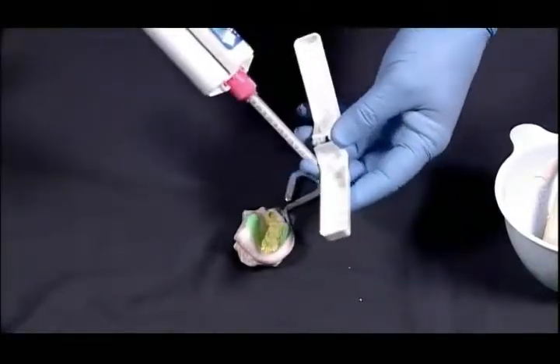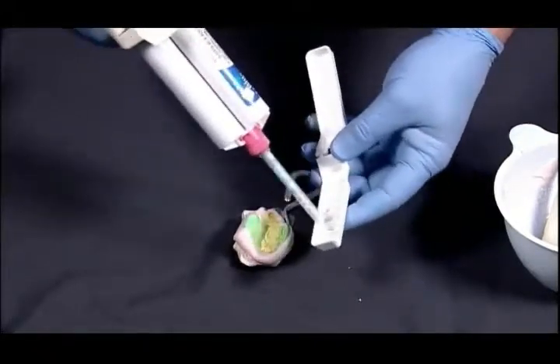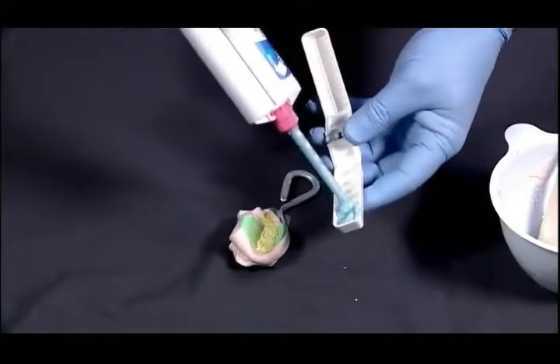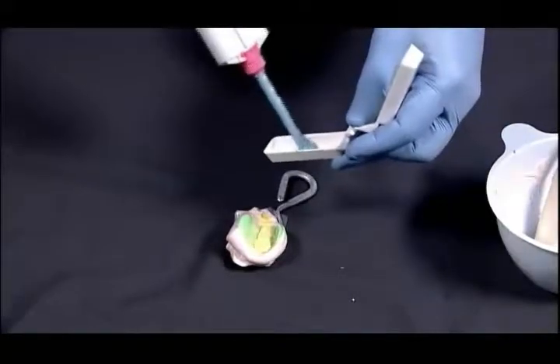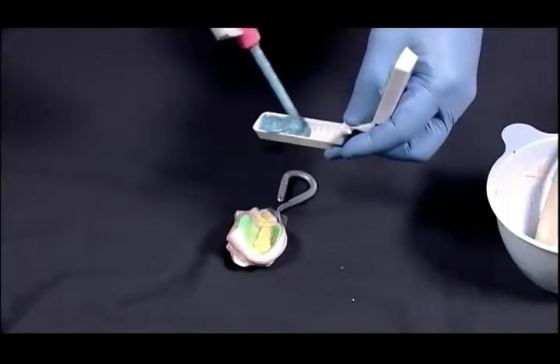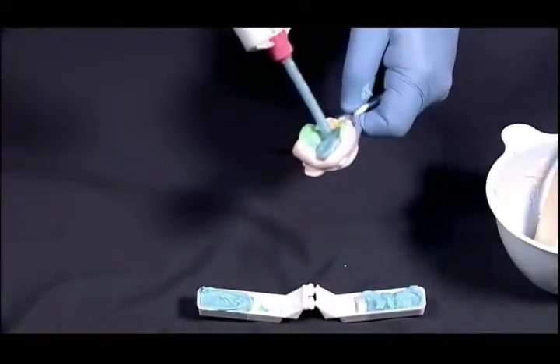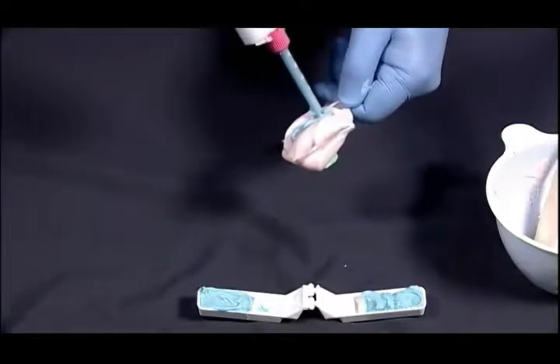This particular case we're using Blue Mousse from Parkell, and I'm going to syringe this as fast as I can into this model because it's going to set up fast under these studio lights. And all we're doing is making sure that we can articulate this whole system back together, so when we're done we have an articulated model to work from. All right, we have that. We're going to start our mounting process. The opposing model I can actually pour utilizing this material. I'm just injecting it down inside of there.